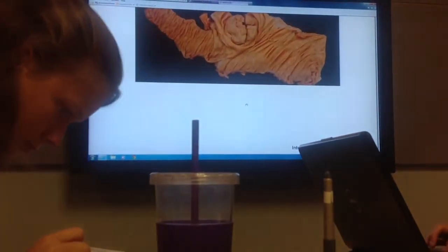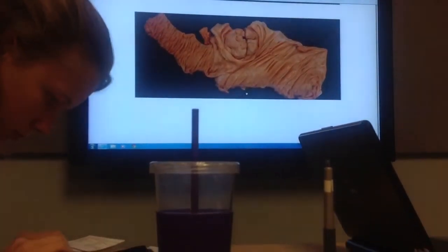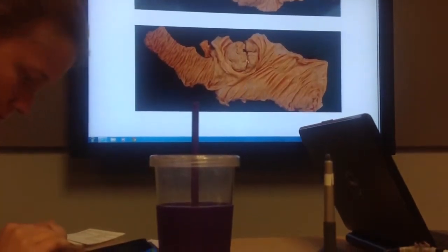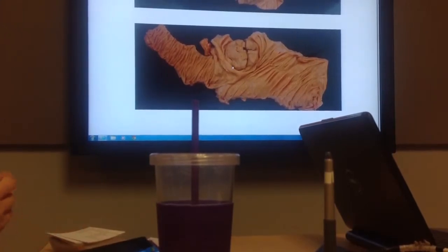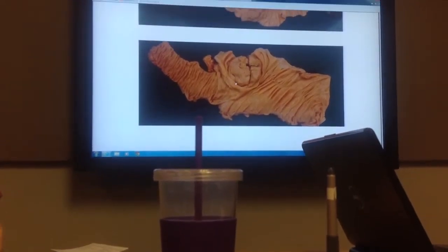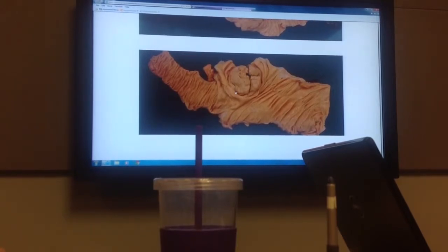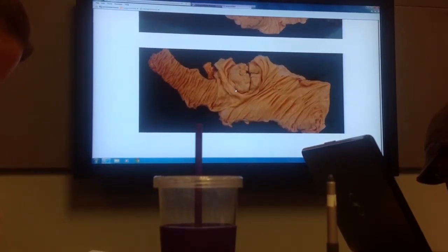Okay. How would you know that? How would we know it is a sporadic tumor instead of a Lynch? What we would do is those 4 immunostains. When we looked at them, we would see that they would all be positive in the control, in the normal glands and in the tumor, because they haven't had a germline mutation and then another mutation, so they retain their staining. So if we have all 4, then that rules out a Lynch syndrome.